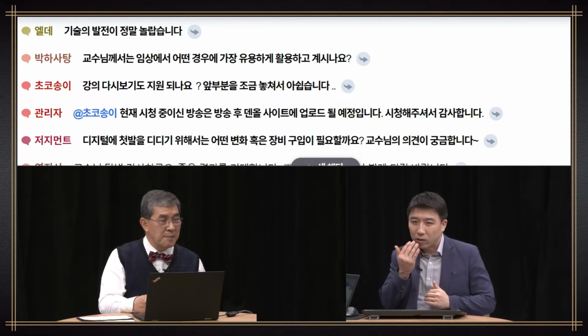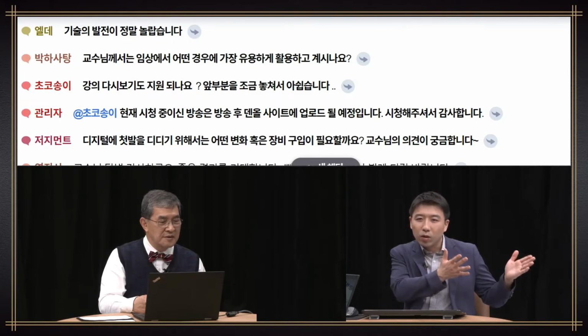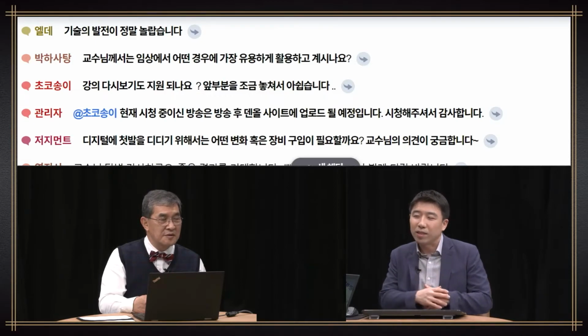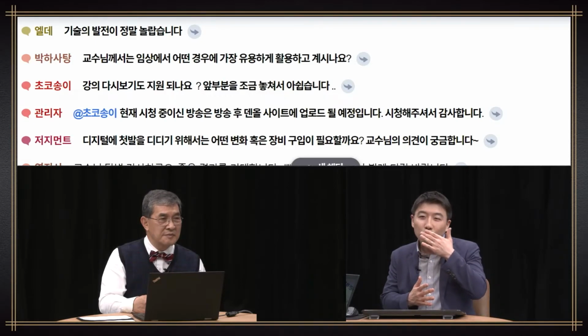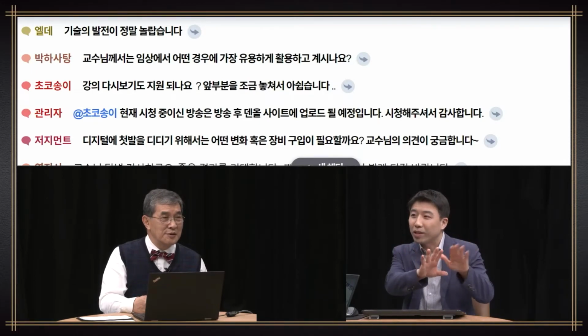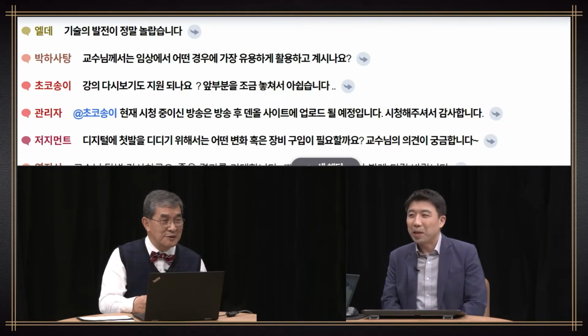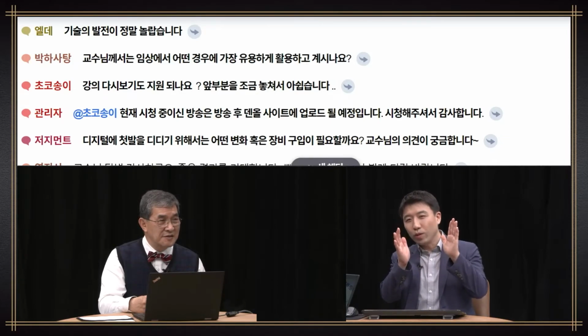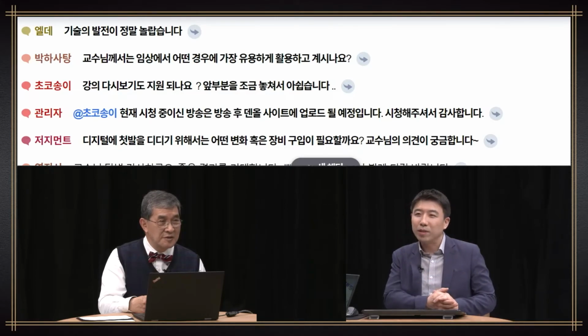Last but not least, for lip support, when you provide a denture or anterior prosthesis to a patient, you can tell how the lip support changes to the patient from the start. The patient can also provide input as to how much lip protrusion the patient wants. Especially in denture patients, patients can have a lot to say about how much the lip is protruding.